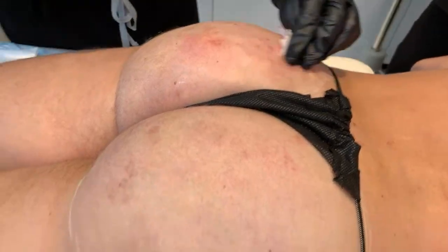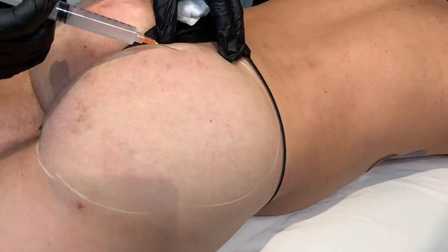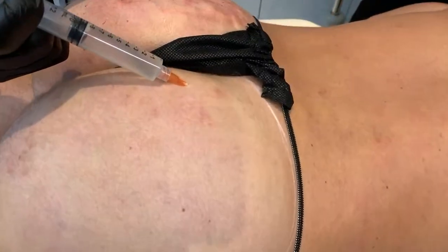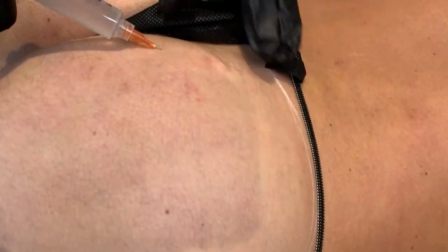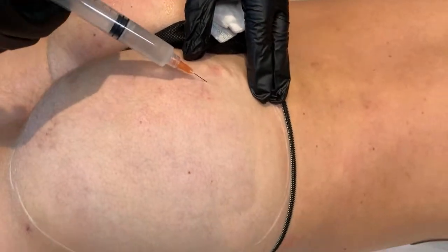So that's done on this side, so we're gonna let that settle in. You guys will see it looks a little hard right now. Squeeze again. Okay, relax, perfect. Little pinch. So now we're gonna start to identify the area on the other side that we now wanna boost. Some people call this a booty boost. You can call it whatever you want.